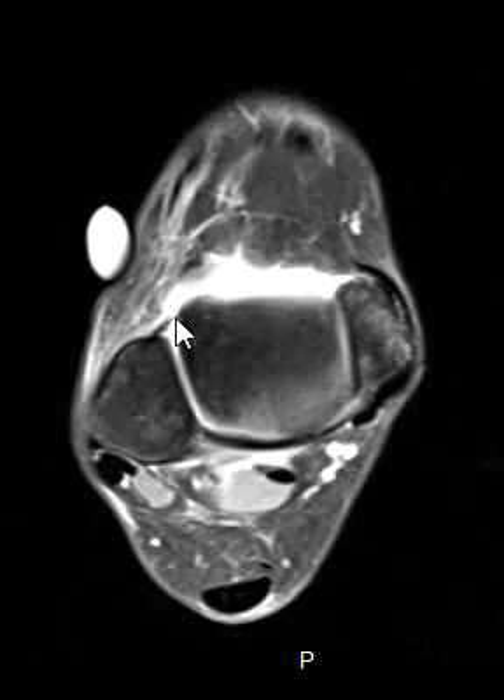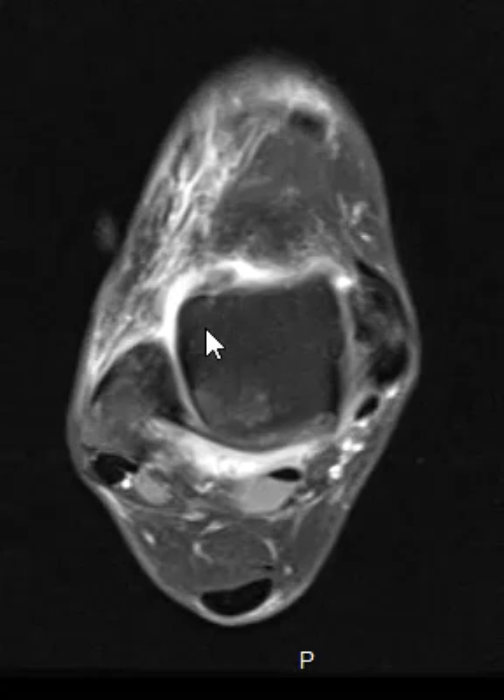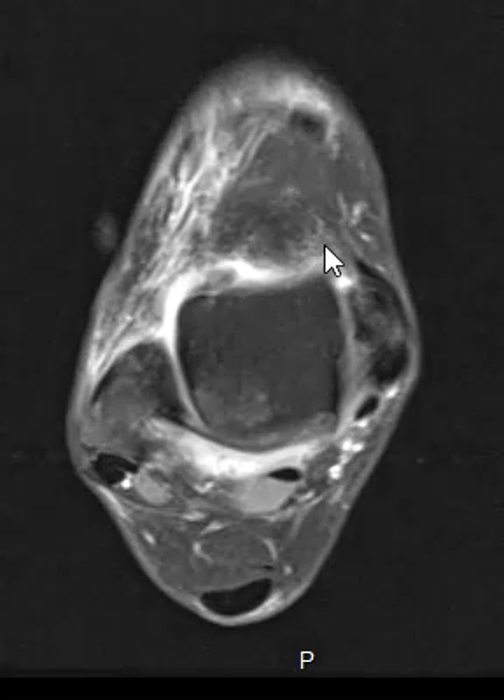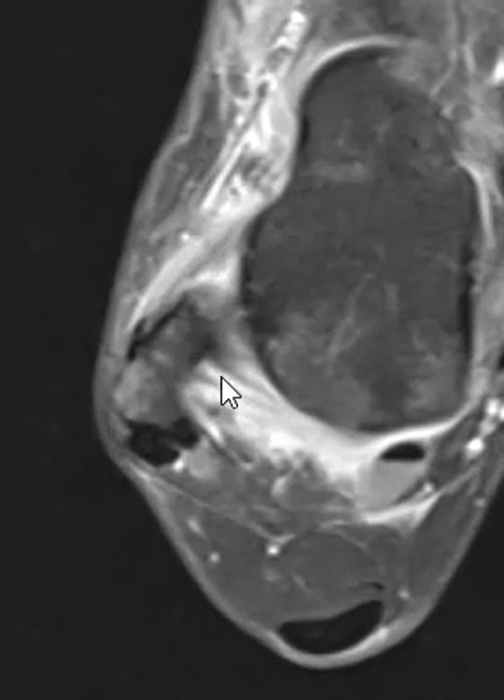There's a marker right here — this white thing is a skin marker — and this is over the anterior lateral outside, the lateral aspect of the ankle, right over where they're hurting. If we look here we can see something that is abnormal. We zoom in here — this is the fibula.